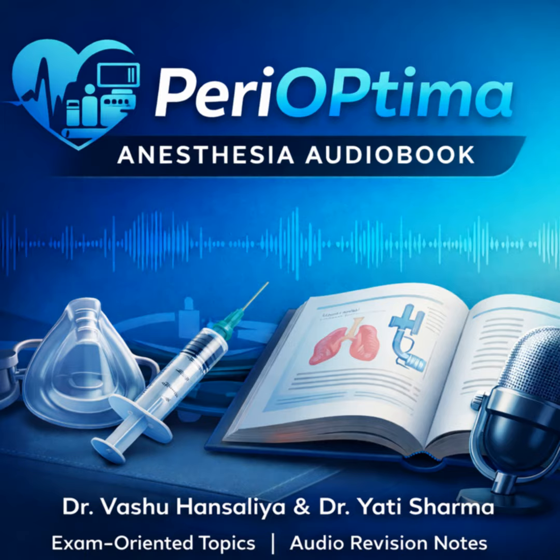Finally, let's give our listeners a model structure for that 20-mark answer. Okay, a high-scoring structure needs a logical flow. 1. Introduction and definition. Define FOI. Establish it as the gold standard. 2. Basic principles of the FOB, with a quick labeled diagram. 3. Detailed indications, a bulleted list. 4. Meticulous preparation. There's a big section: counseling, positioning, drugs, oxygenation.